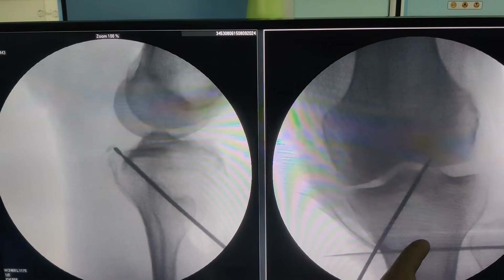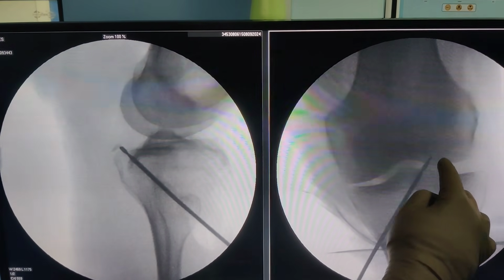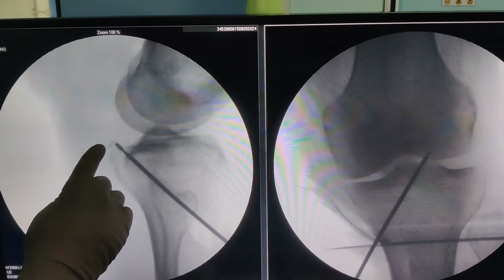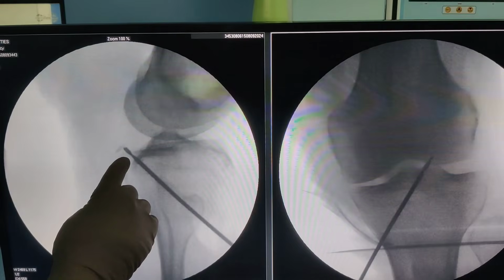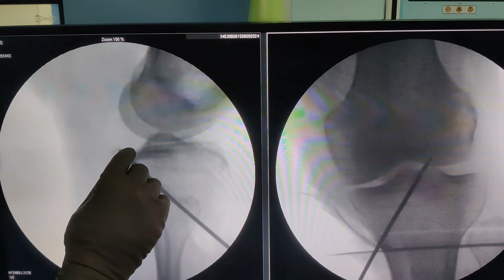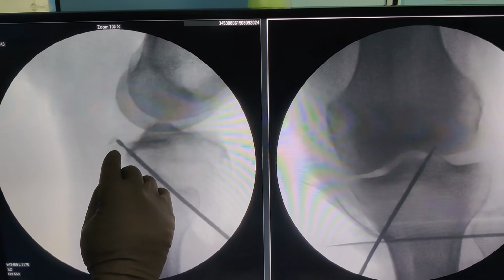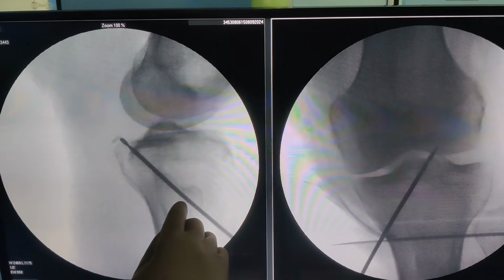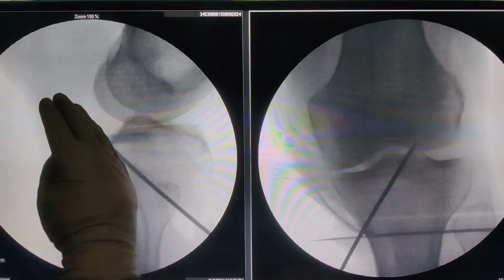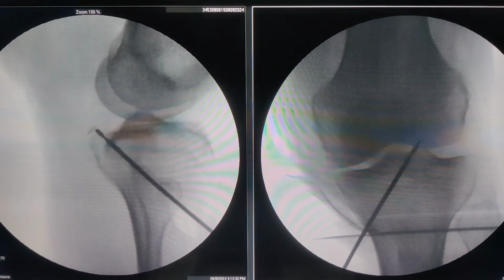Look at the AP. These are our two views. So this is AP, this is the center, this is slightly lateral, that is what we want. This is the fibula. This is the slope, this is the bony avulsion, you can see. So our drill is just there. This is an 8 mm graft, so once we drill it, it's going to be there. What you don't want is to be high. You have to be as low as possible at the level of insertion of the origin of the PCL, because then you avoid the killer turn. So to avoid the killer turn, lateral and as low as possible. If you don't know about the killer turn, just read about it. This is the biggest problem while doing the PCL.